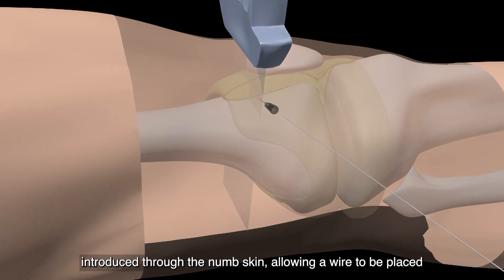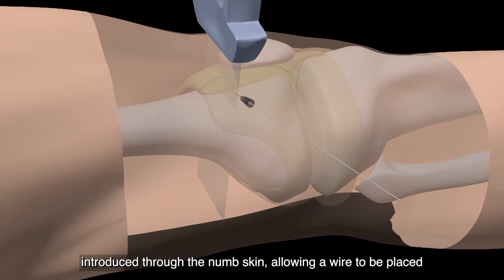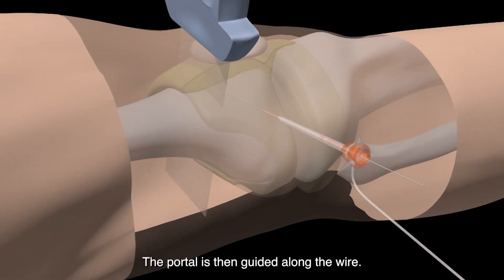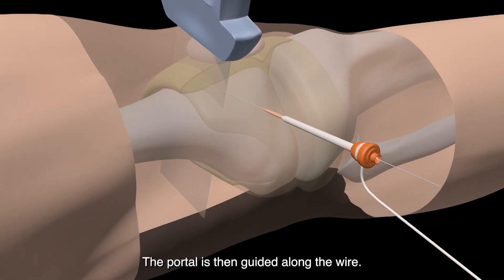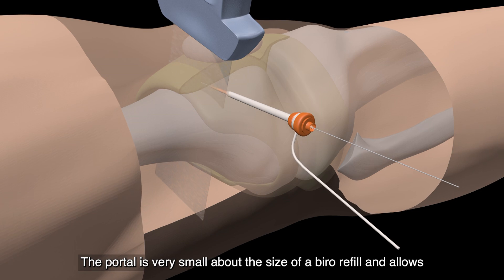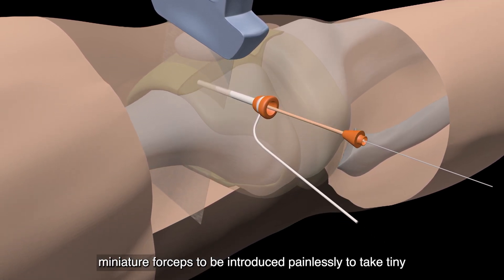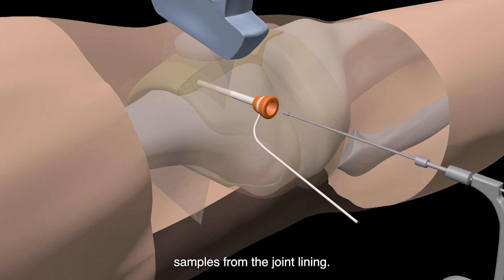Another needle is then introduced through the numb skin, allowing a wire to be placed inside the joint. The portal is then guided along the wire. The portal is very small, about the size of a biro refill, and allows miniature forceps to be introduced painlessly to take tiny samples from the joint lining.